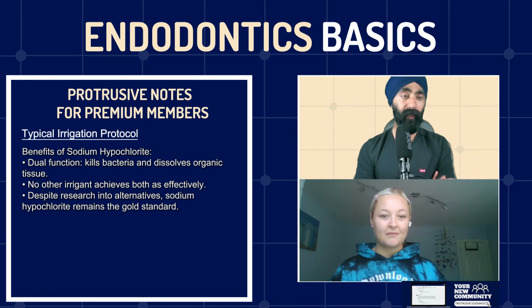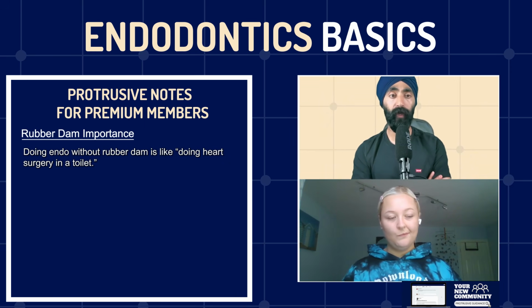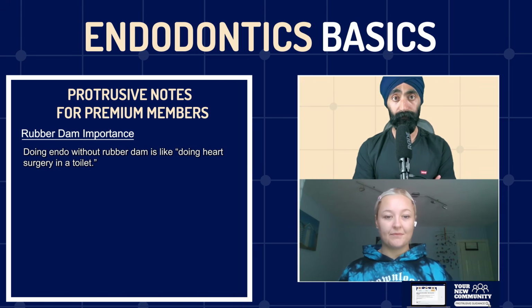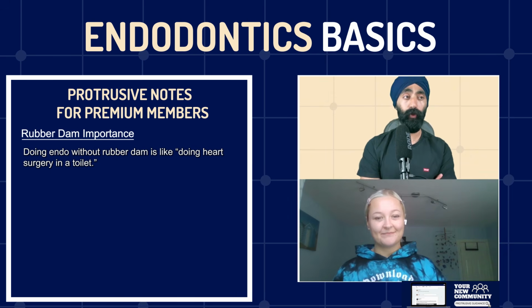People always say rubber dam, right? We haven't talked about it, but doing root canal without rubber dam is like doing heart surgery in a toilet. Literally, that was the way it was explained to me as a student, and I think it's so key.